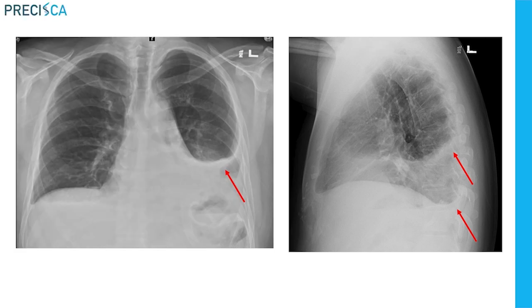Now, here's another patient who is standing up, and what we call here is a frontal X-ray, and this is a lateral X-ray obtained from the side. So still standing up. While this patient is standing, we see, again, this white part is fluid, which goes down into this pleural cavity because it's heavier. And a little bit of blunting here, which is a small amount of fluid. On this lateral radiograph, you see this is the left side with a larger amount of fluid. It's also sinking to the bottom, and this is a small amount of fluid on the right side. So these are pleural effusions, and in the middle, as I mentioned before, is the heart. So the white part is the fluid.